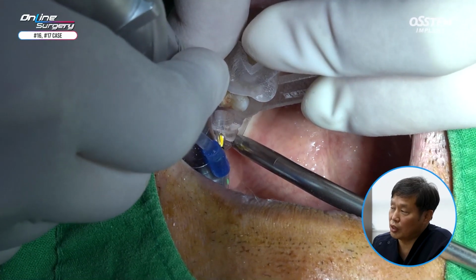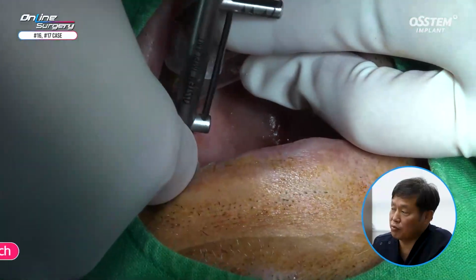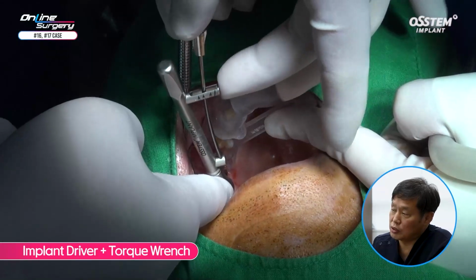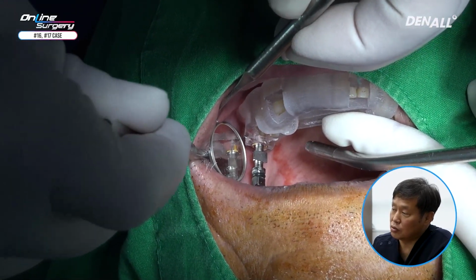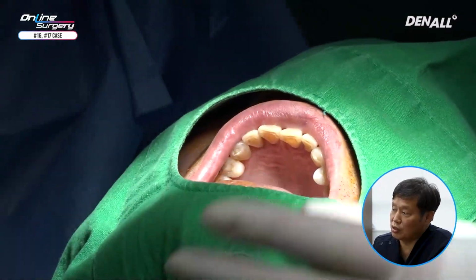I think the bone is less hard here. The final drill was done up to 3.8, and the implant is placed. A torque ratchet implant driver is used to get the final implant position. It is slightly less than 30 Newton centimeters. Yellow marking and the triangle are utilized.